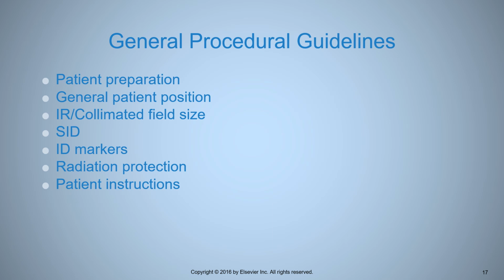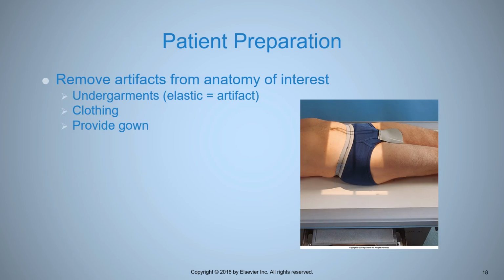Further patient's instructions, they do have to disrobe from the waist down. That's the best instructions. Put on a gown, cover them up, make sure you tell them to keep their underwear on. There are people who share way too much, if you know what I mean. So make sure you specifically instruct them to keep their underwear on. Cover them up with a flat sheet just for extra privacy. That's just courteous. Okay. All right, so we go into, and I think this is a male patient with a contact shield. Okay.